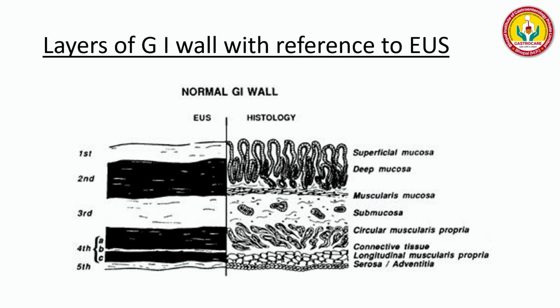So the idea of luminal malignancies, and where EUS is better for loco-regional staging, is that we know the five layers of the given luminal wall can be better differentiated with EUS as hyper and hypoechoic areas. Depending on which layer is involved, we can give the T staging.